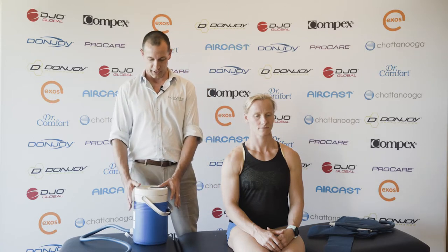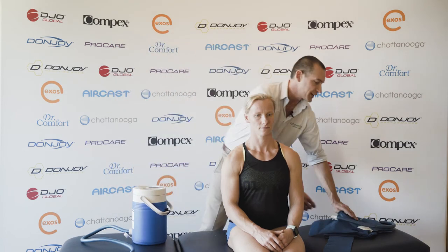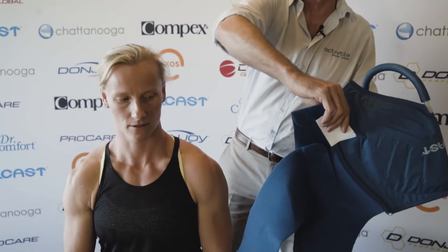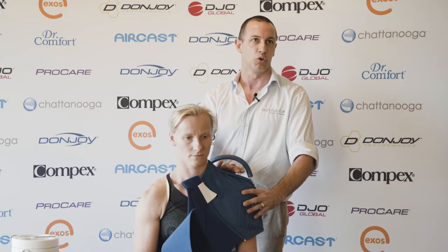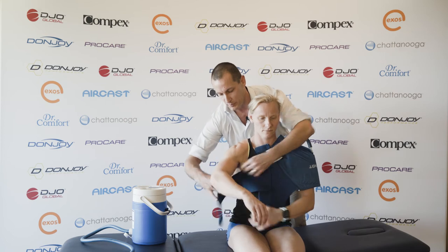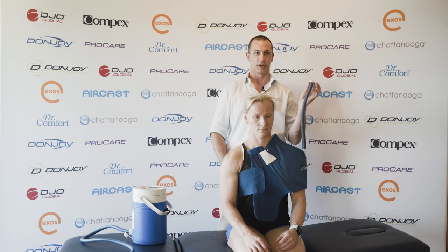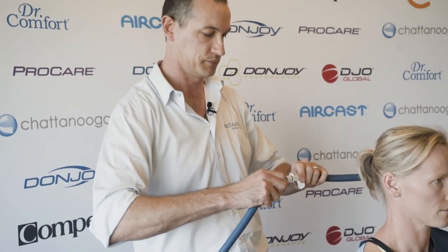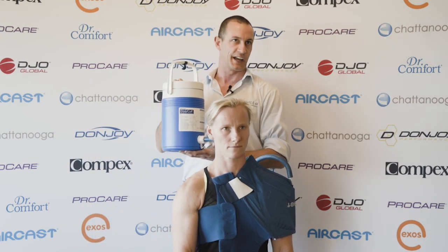So what we've got here with the cryo cuff is the Esky. Take the lid off, fill it up with ice and water, and in this case we're going to take a look at the shoulder cuff. It's very easy to fit — place it over the affected shoulder, so after a rotator cuff surgery or arthroscopic repair, wrap it around to the back. There's a little tube coming off the back of the cuff; connect that up with the Esky and we're going to use gravity to feed the ice down into the cuff.